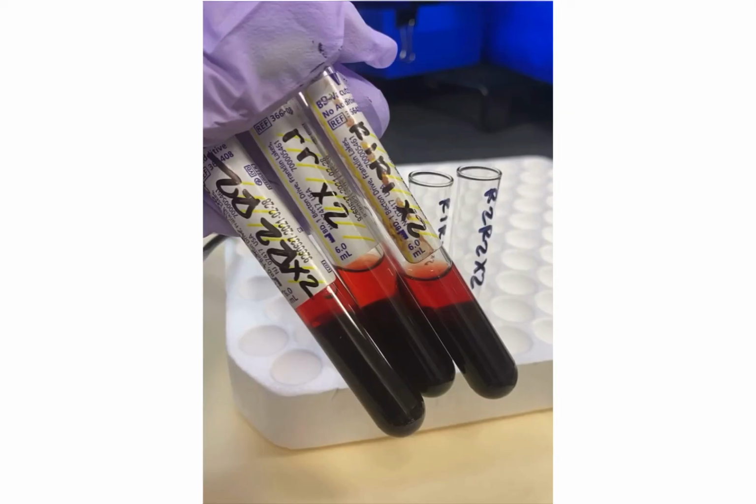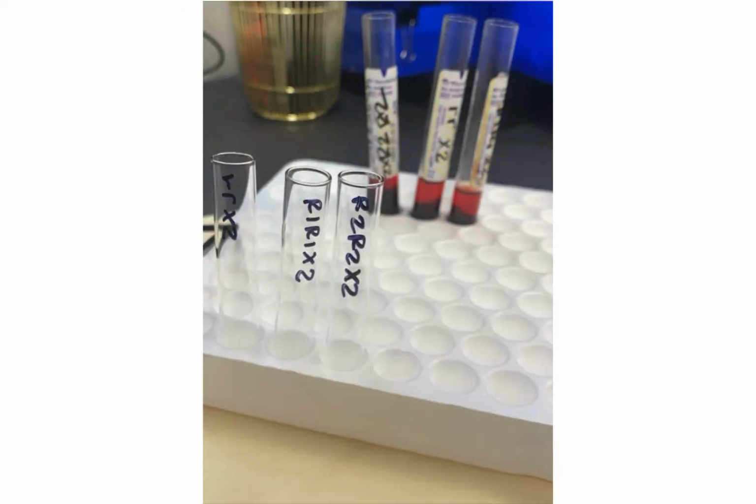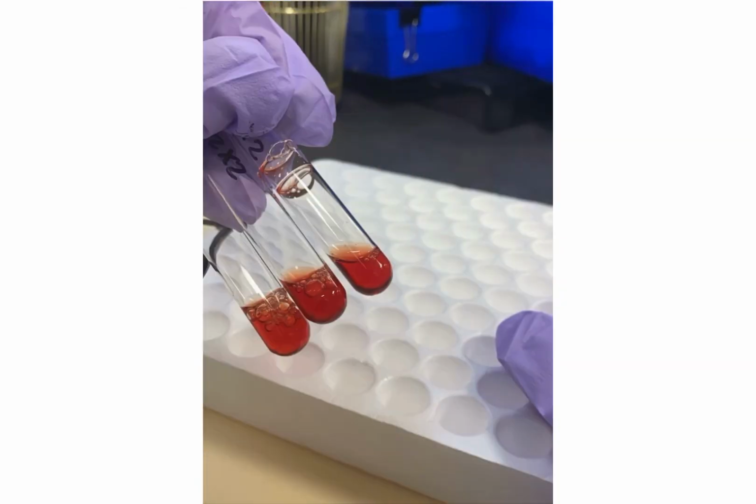We'll talk about this more later on, but in more high complexity level testing, we can take the donor reagent red cells which have an antibody on them and perform an elution procedure to remove the antibody and then test that antibody specificity. Also, at the end of this video, you'll see our adsorbed plasma by itself, which is ready for testing. As you can see, we have a very limited sample, so it's important to be conservative.